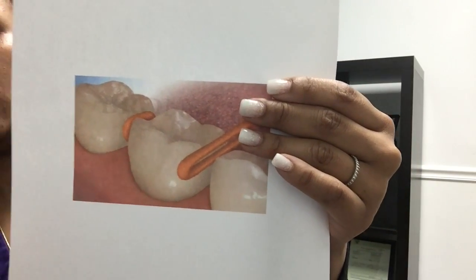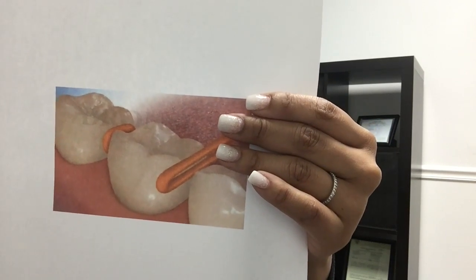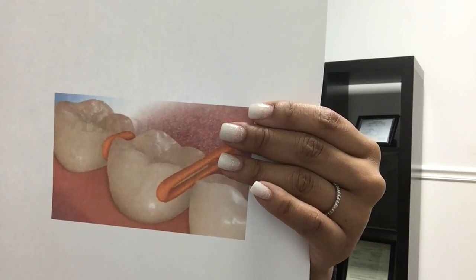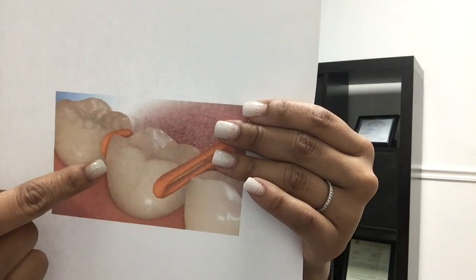So for example, if you're getting an appliance like an expander or anything like that, more than likely we will place the separators in between your molars. Your teeth are moving, creating room — moving apart to create enough space so we can fit those metal rings, or the bands as we call them.